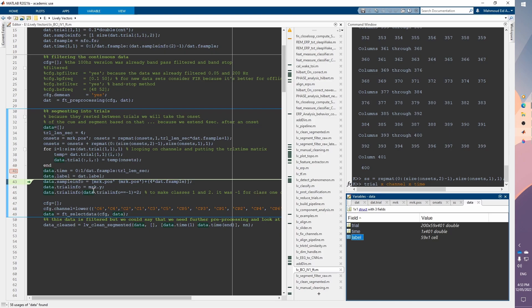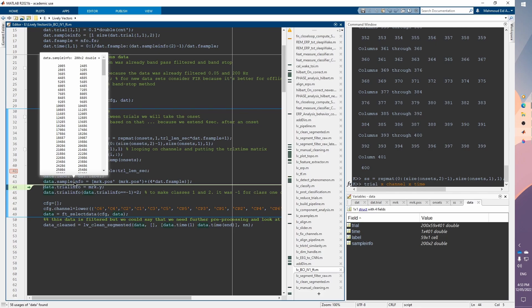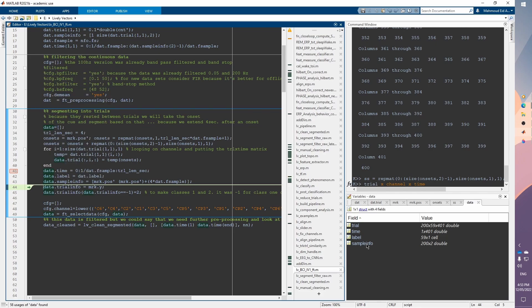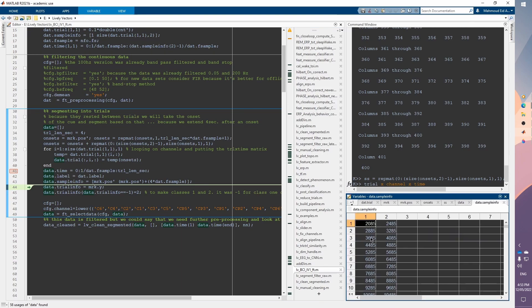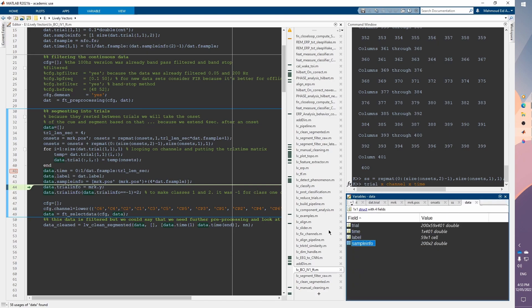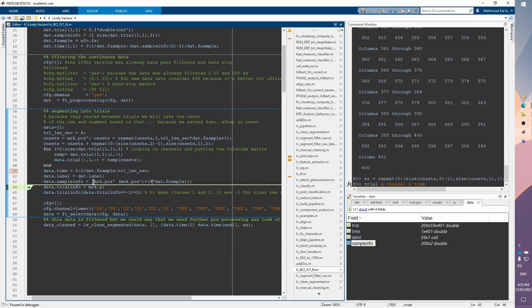We also have 'sample_info', which is 200-by-2 and contains the beginning and end sample of every trial — it's the onset position plus 400 samples. This can be handy in certain analyses. I take the original marker positions as columns and then add 4 multiplied by the sampling rate, which gives the number of actual samples in the trial.